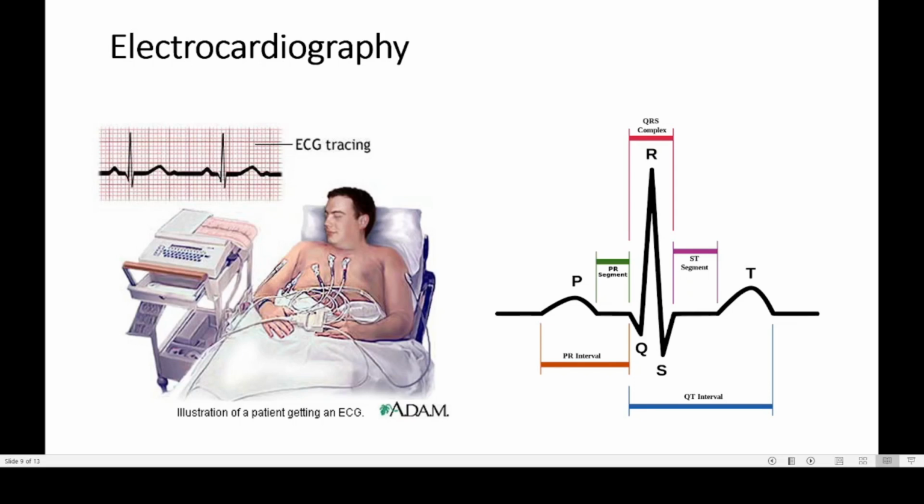The P wave is normally developing during the contraction of the auricle. So if there is no P wave in that person, that indicates that there is something wrong with the contraction of the auricle in him or in her. So that is the meaning of the P wave.